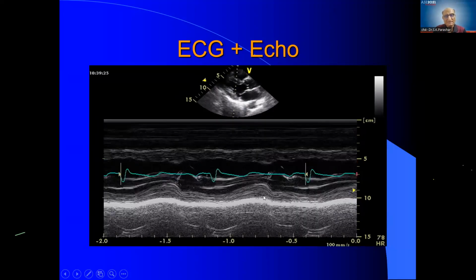And of course, you see a ventricle contracts in systole and dilates in diastole. Here is the LV dilatation which is occurring in diastole, and this is contraction which occurs in systole, going from the QRS to this. So these are some of the things. This is ejection of the blood, and that is why the muscle thickens in systole.